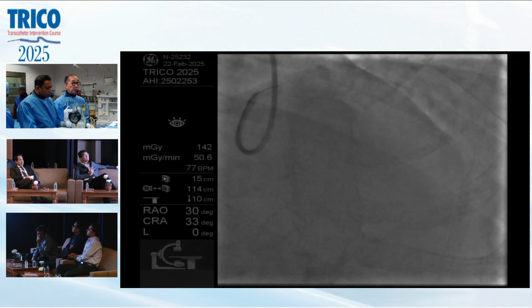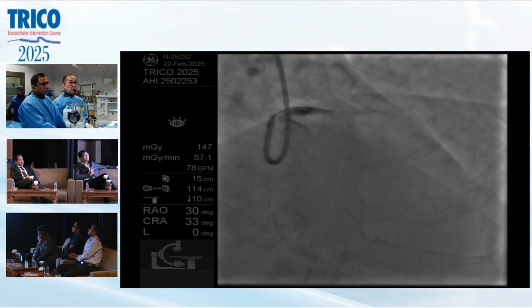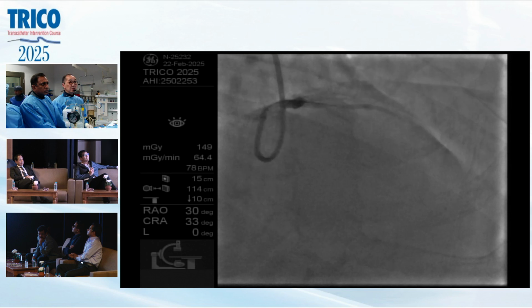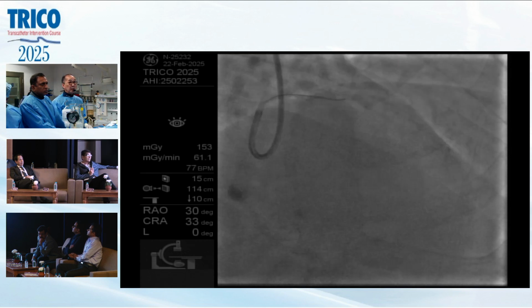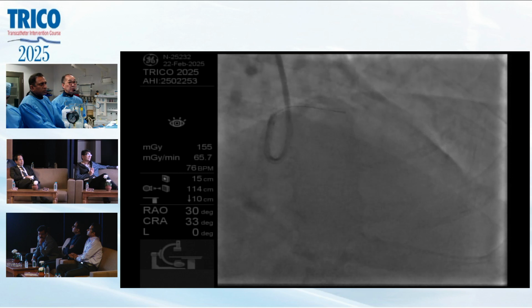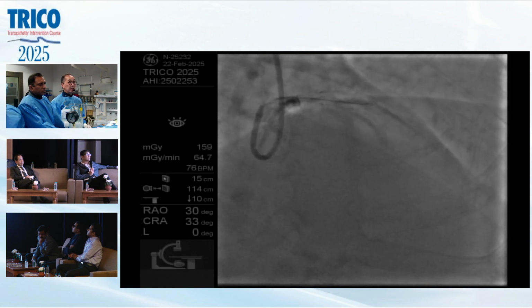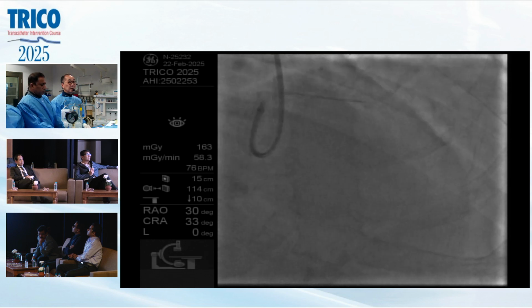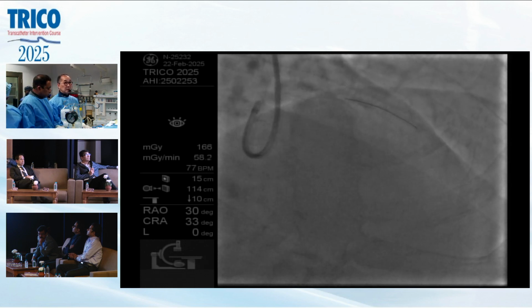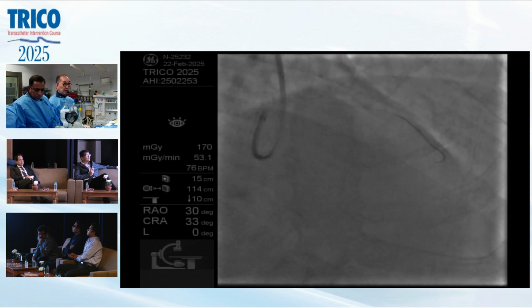So my plan is to wire both lesions, both vessels. We balloon that and IVUS it, and then we decide what kind of technique we're going to do. All right, let me take this vessel first. Now, can I have a second line? Yeah, it's ready.